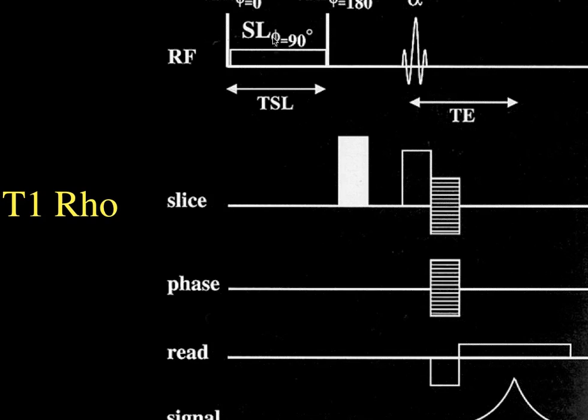And as we talked about before, what causes contrast with T1 is the interchange between the lattice molecules, the big molecules, and the nuclear spins. We also talked about before that how efficiently we can get the Z component of bulk magnetization to grow along the Z axis has to do with how many photons from the lattice are present at the Larmor frequency.